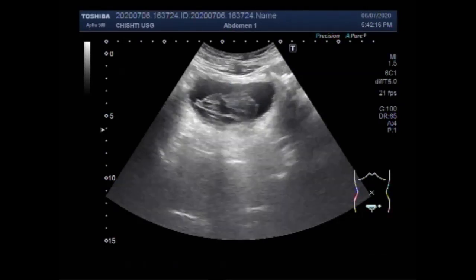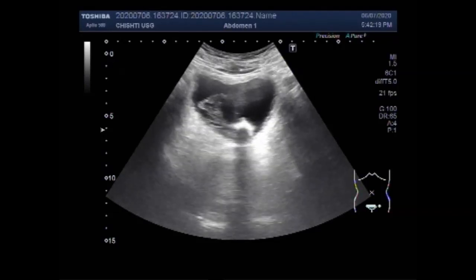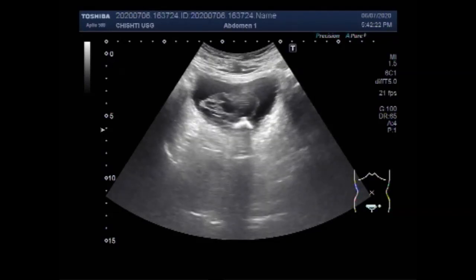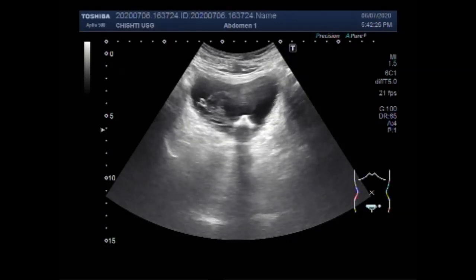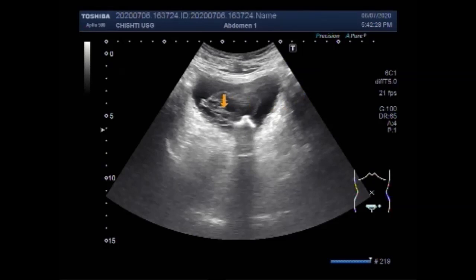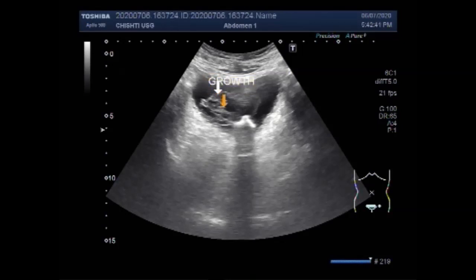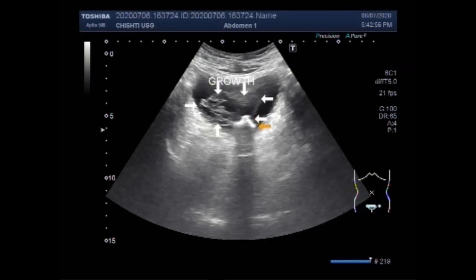Now you can see a large growth in the urinary bladder, located at the base of the urinary bladder and adjacent to the left bladder wall.